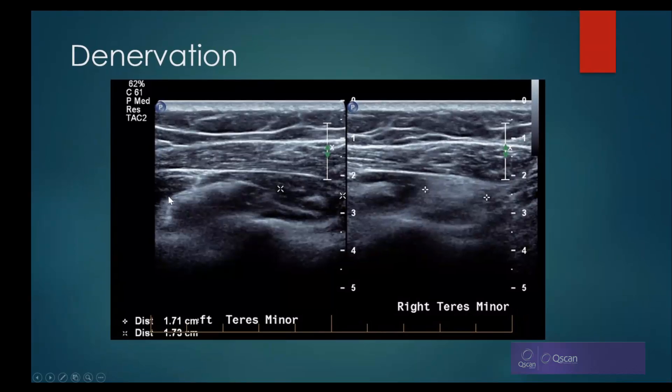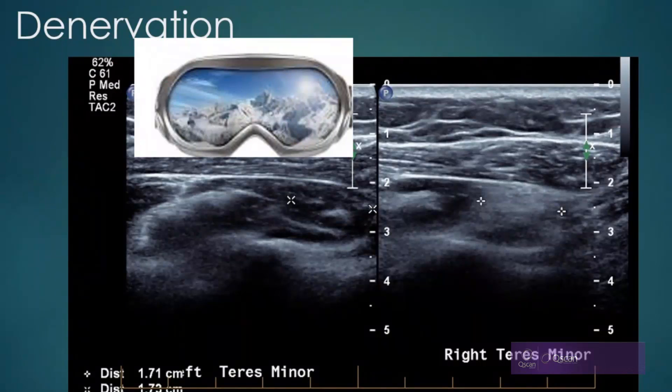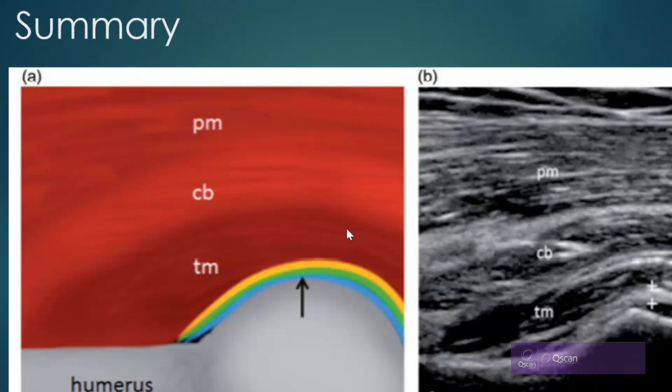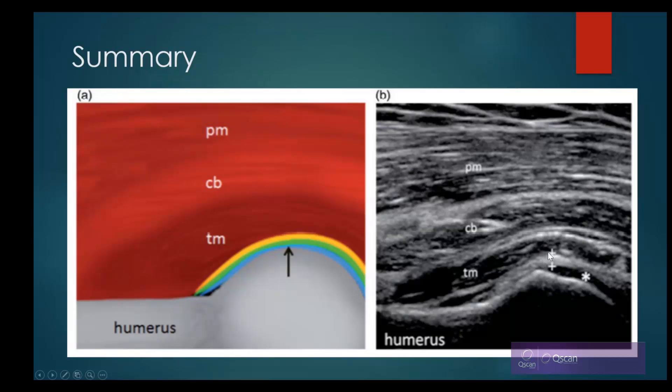In another patient, the ski goggle view shows normal infraspinatus and normal teres on one side, and abnormal teres on the other — very helpful for working out why a patient can't externally rotate. In summary, measure the inferior glenohumeral ligament at the level of the humeral head, exclude the hyaline cartilage, and position slightly anterior to teres minor for accuracy. This measurement is now being added to worksheets. The take-home message is always compare both sides — if it looks different, signal that further investigation and the right treatment may be needed.